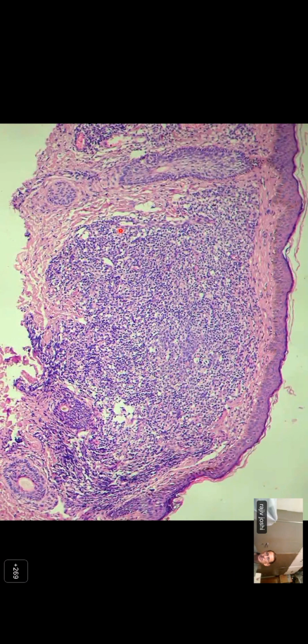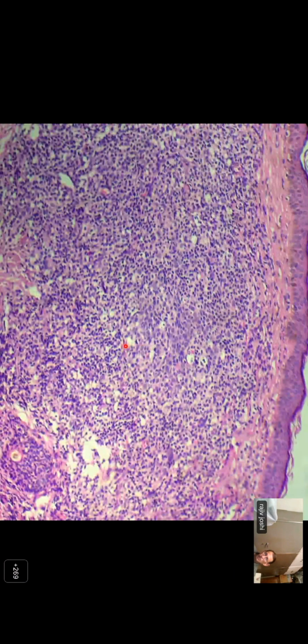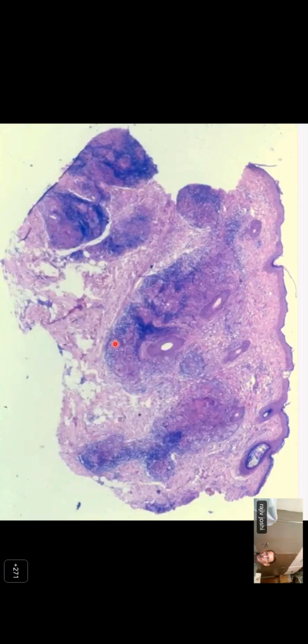Depending on which cells there are, if you have, say, lymphocytes, this is a pseudolymphoma with a small germinal center in the middle. Or you can get granulomas. So granulomas is a subset of nodular dermatitis. You get well circumscribed nodules of histiocytes, epithelioid cells, giant cells, accompanied by lymphocytes. The intervening dermis is normal. And here the granulomas are seen to preferentially involve the adnexal structures.